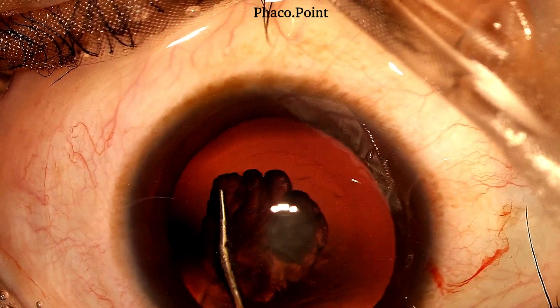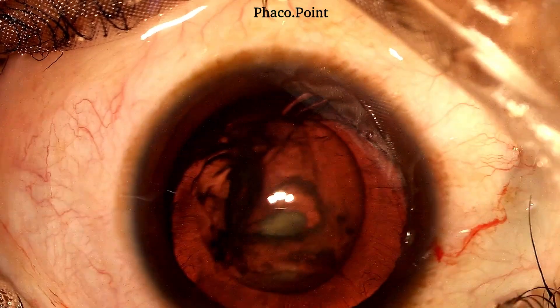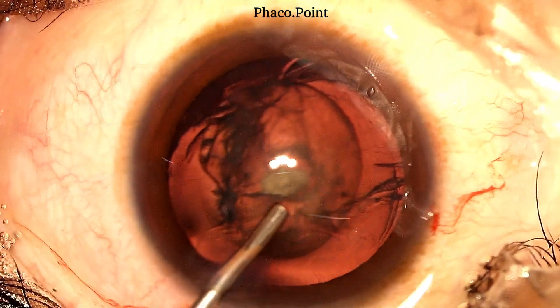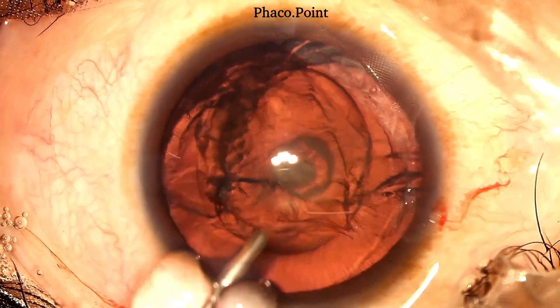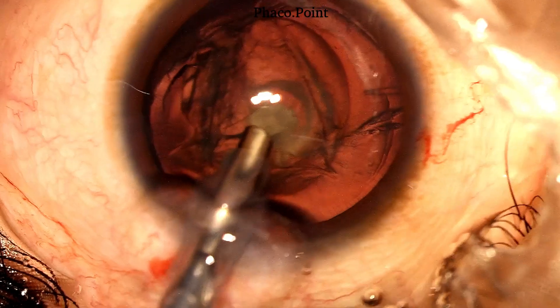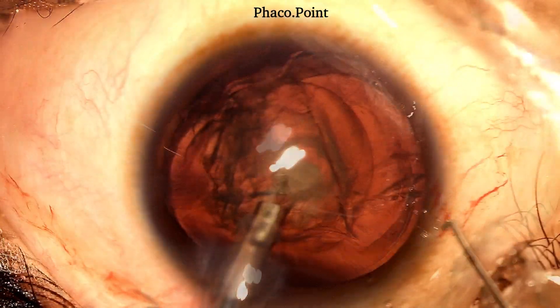The next step is the hydrodelineation. Having completed the hydrodelineation, we now introduce some viscoelastic to maintain the anterior chamber prior to the nucleus management.